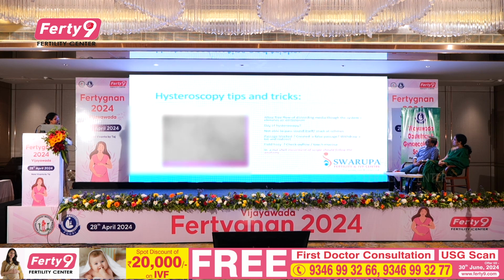Always allow free flow of distending medium through the system, which will eliminate the air embolism. You started your hysteroscopy. I'm doing a hysteroscopy with normal saline. Always see to it that the IV set or the TURP set which you are using is already full. The tube is already full, so that air embolism doesn't occur. This is a very important trick the beginner should know.